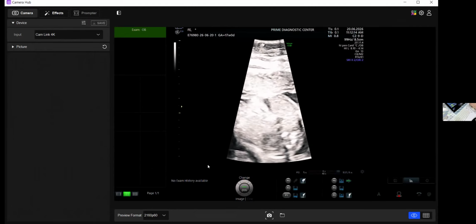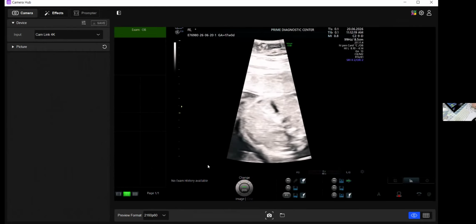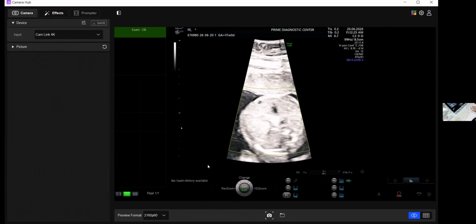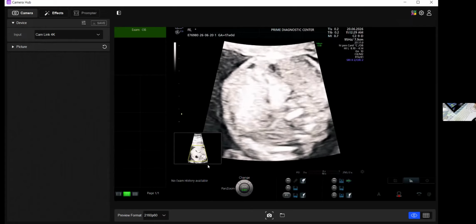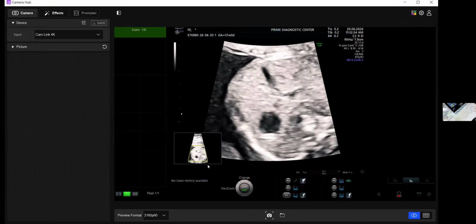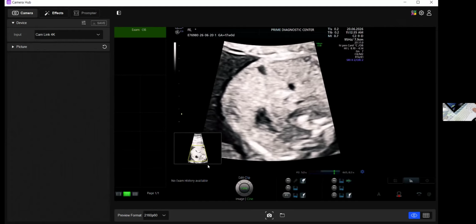So now here again, the abdomen, we'll just quickly scan this and zoom this area. Okay. So this is a kind of habit which I've formed over a period of time, to just zoom and see it. And then on the 2D, you can see the structures. And again, it's the clockwise rule.